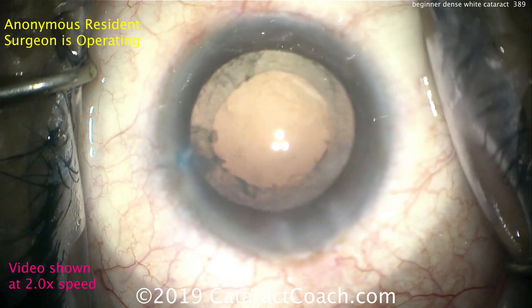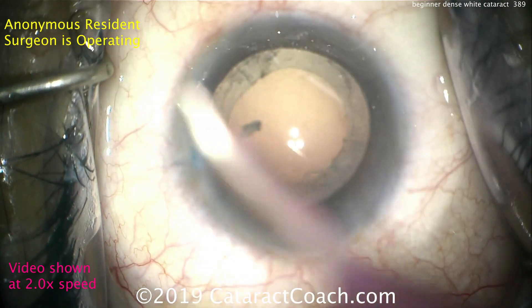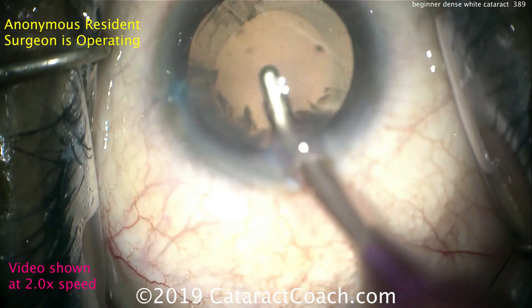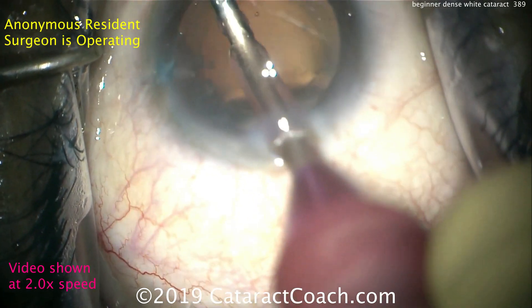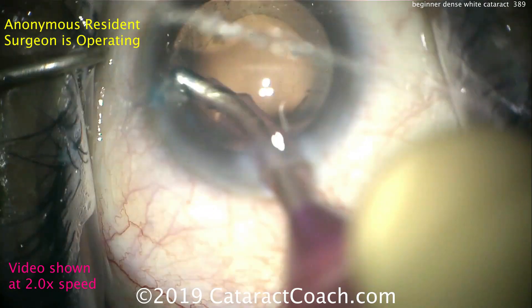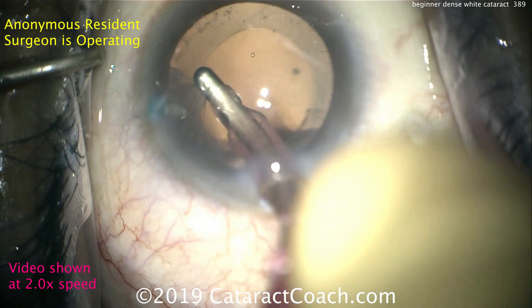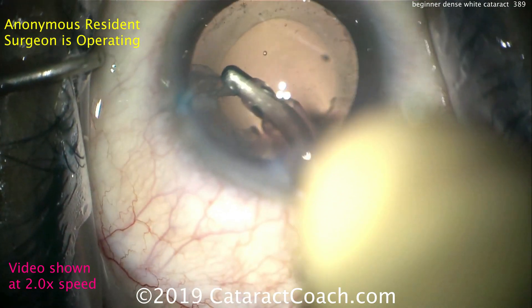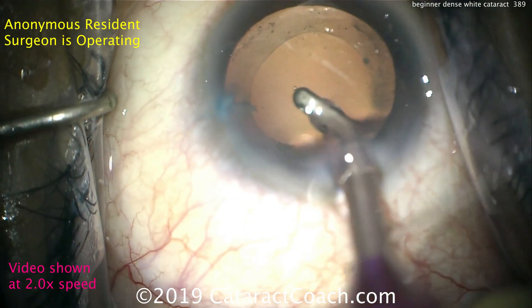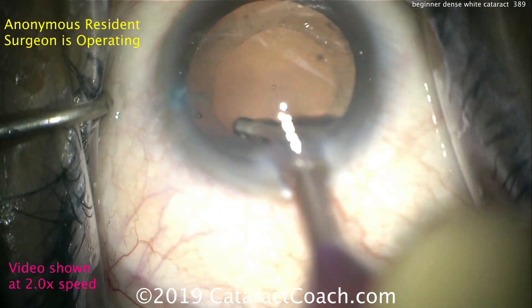Eye in the aphakic state — time to remove some lens cortex. Keep in mind we are showing the video at double normal speed. The video is unedited and sped up to fit a reasonable time frame. The IA probe is going in the eye. Notice that in the paracentesis there is a little chunk of nucleus that will have to be removed. Cleaning up the capsular bag, stripping out the lens cortex. The eye is being kept in primary position pretty well, with good pivoting technique using a standard coaxial IA tip.